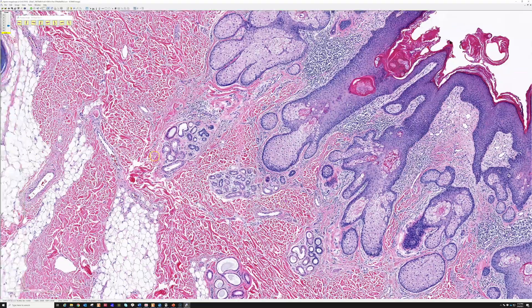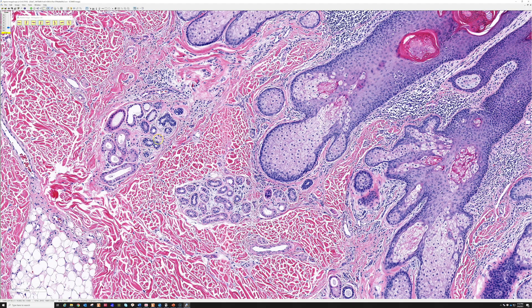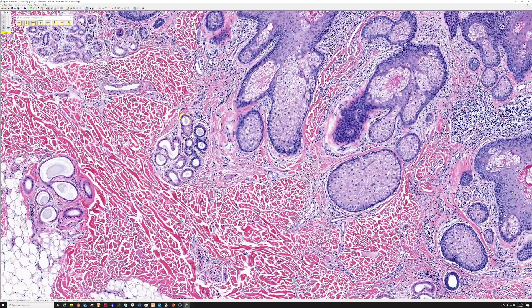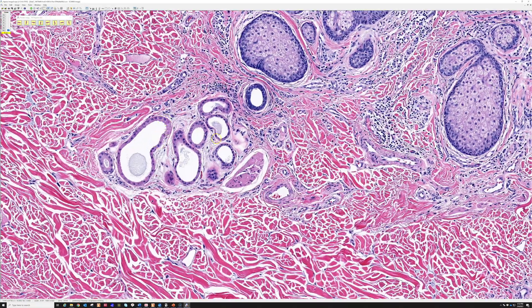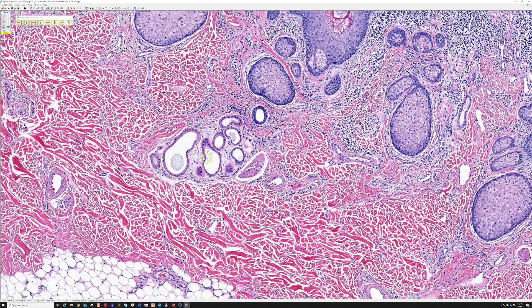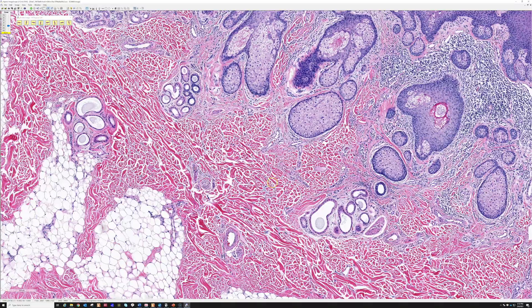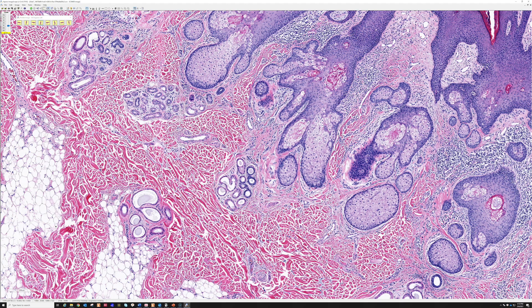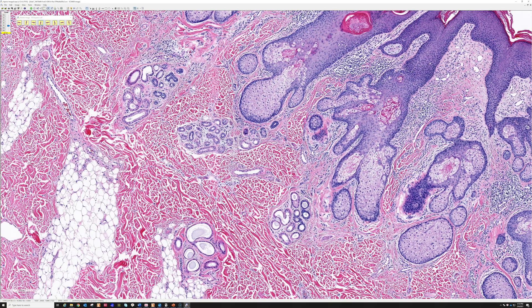Here's a good example of glands that look more like regular eccrine, and over here they still have a little bit of the apocrine quality. Anytime I see apocrine glands on the scalp, I'm going to instantly think of nevus sebaceous, because you don't normally have apocrine glands on the scalp. Normally apocrine glands are in the axilla and anogenital skin; you also see them at the margin of the eyelids — the glands of Moll — and around the nipple.